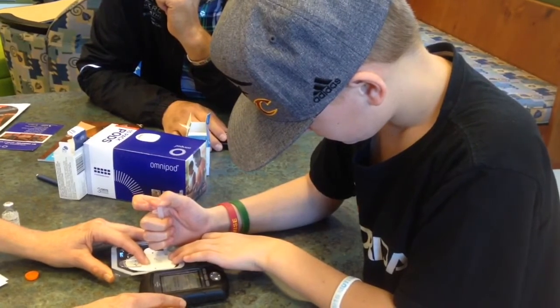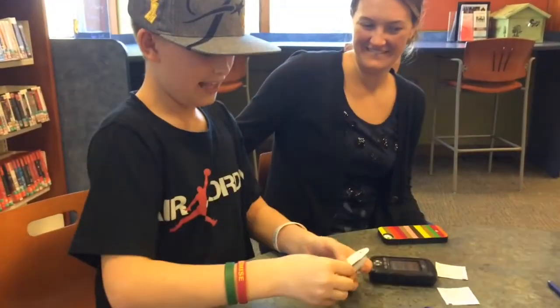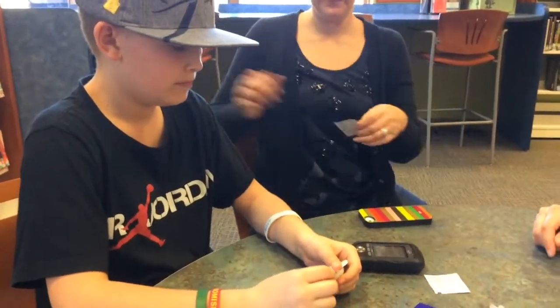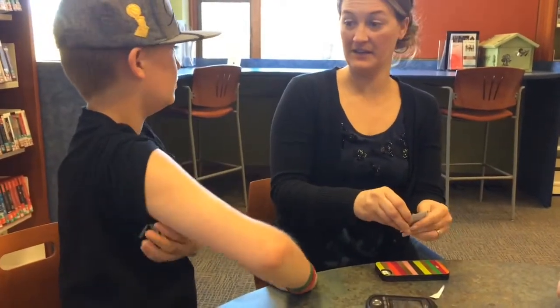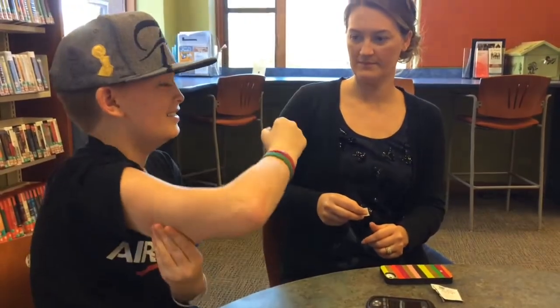Awesome. Good job, honey. Now we take the air out. And did we already clean off your arm? Not yet — okay, so we'll do that first. You want it on that arm? Yeah. Do you want this part, Daylon? Like if you're making a muscle, it's the part underneath there.